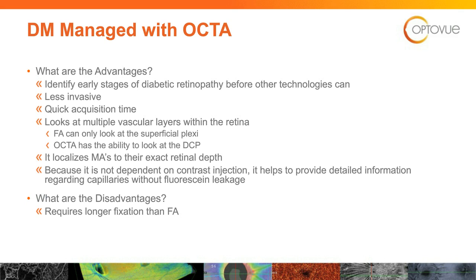It has a smaller field of view. OCT angiogram, again, we've utilized this up to 8 millimeters. You can montage it up to 12 millimeters, and technology is looking better and better to getting even beyond that. But fluorescein really can go from very peripheral retina to very peripheral retina. And so you can't get out quite as far, harder to view the image peripherally, but that's one of the downsides.